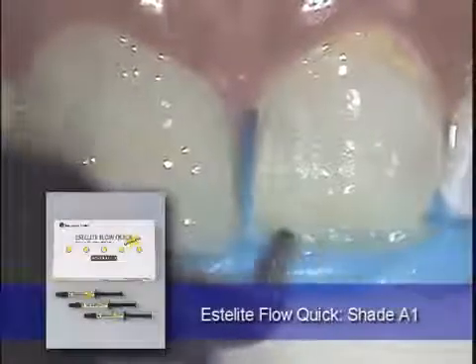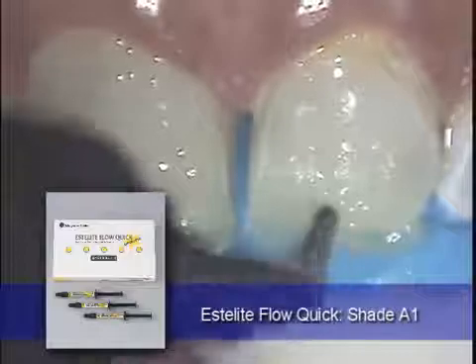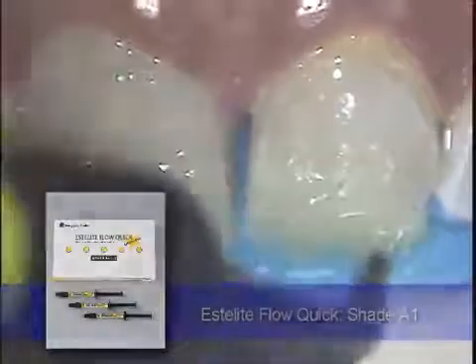Here, in a small deviation from the first technique used on the upper right central incisor, a small increment of Estelite Flow Quick is placed at the incisal edge in order to provide a completely restored incisal edge.